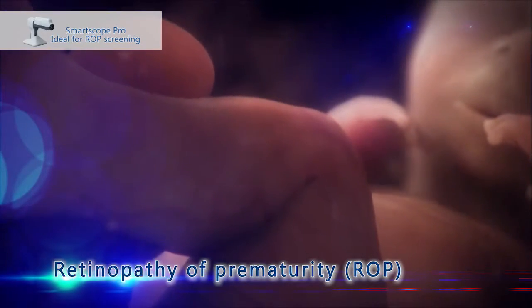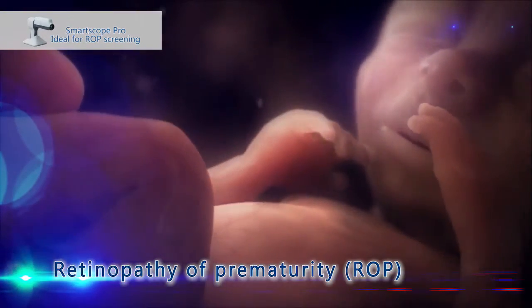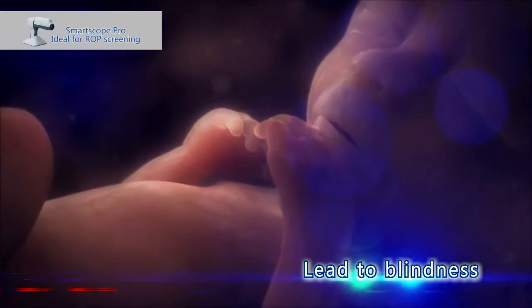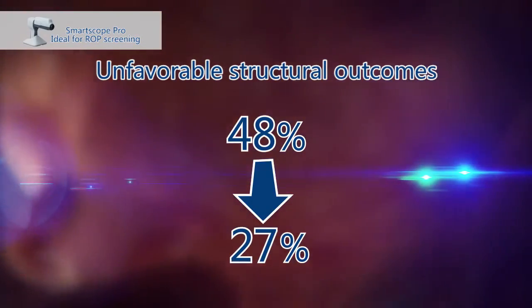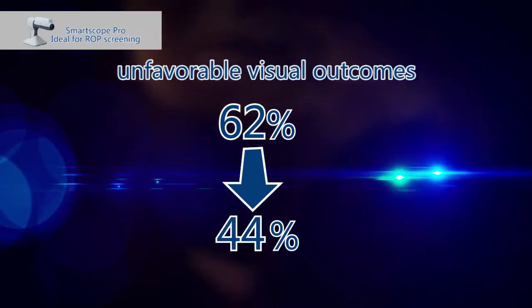Retinopathy of prematurity is a disorder of the developing retina of low birth weight preterm infants that can potentially lead to blindness. With proper screening and treatment, unfavorable structural outcomes were reduced from 48% to 27%, and unfavorable visual outcomes were reduced from 62% to 44%.